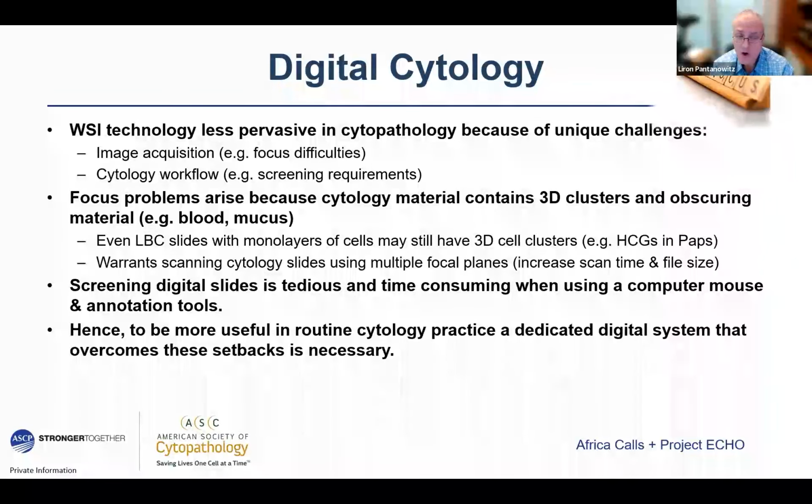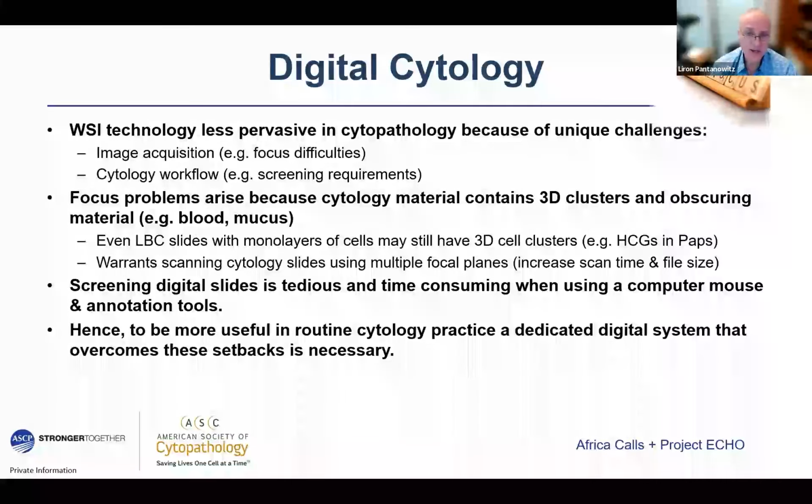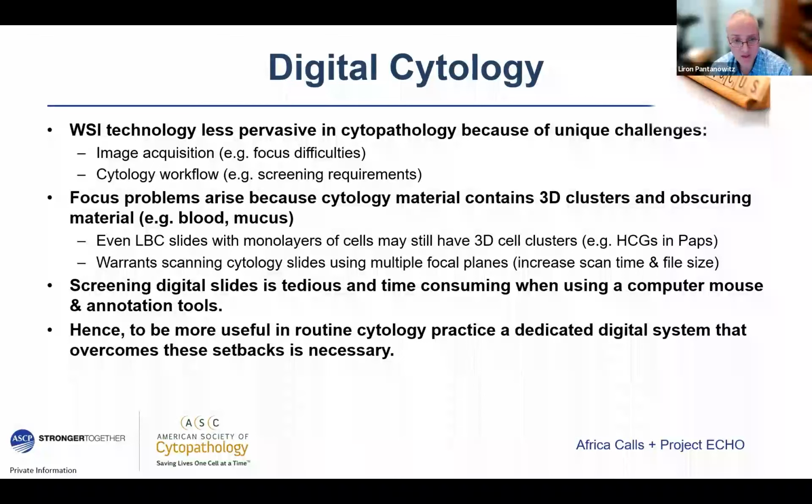Now, as mentioned, whole slide imaging technologies are not as pervasive in cytology for two main reasons. One, it's hard to make a good image. The image acquisition has problems, mostly due to focusing. And two, the workflow in cytology is a little different.